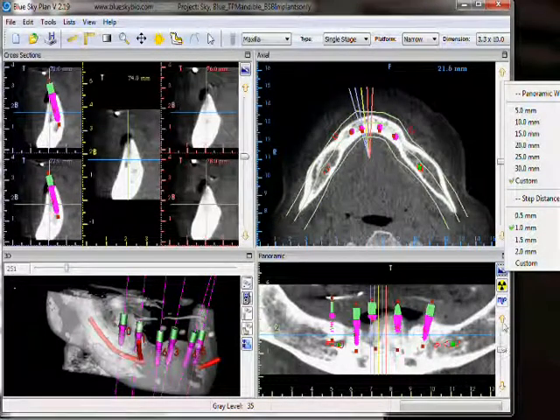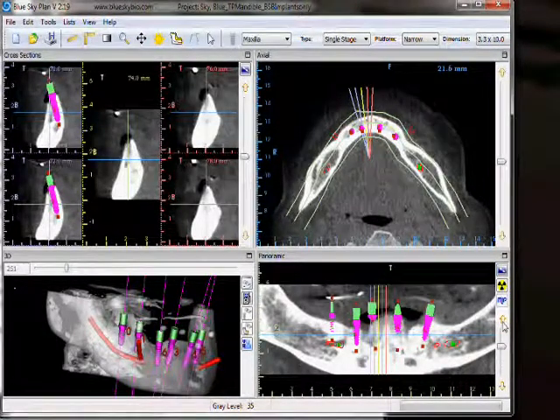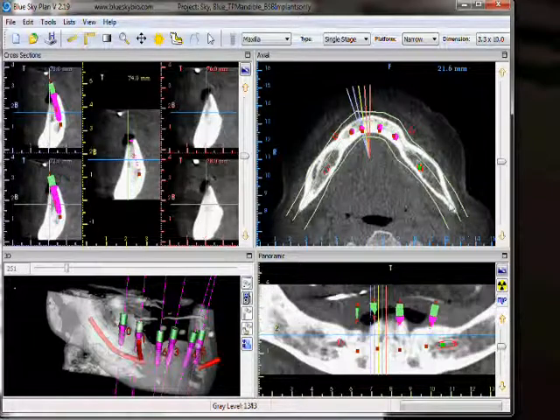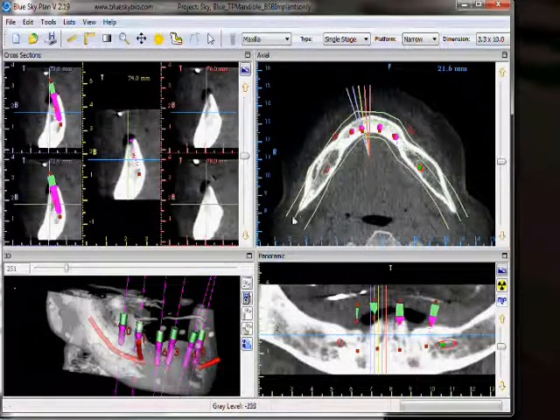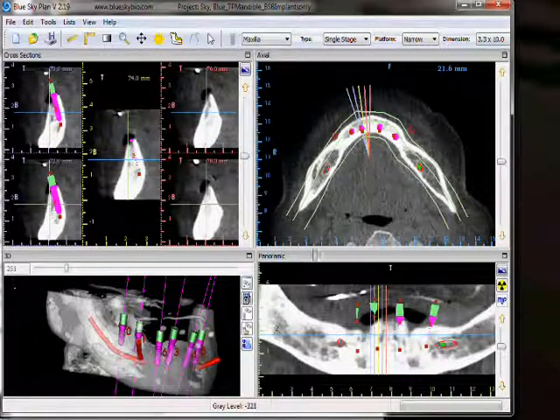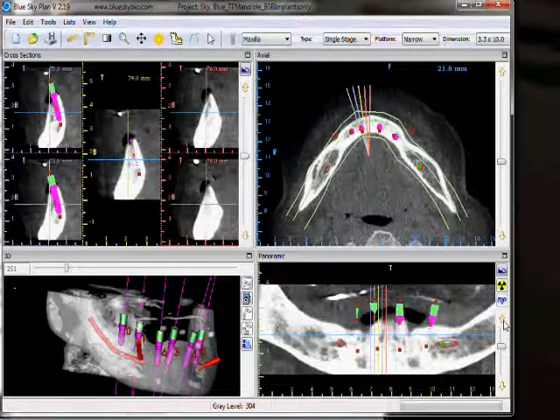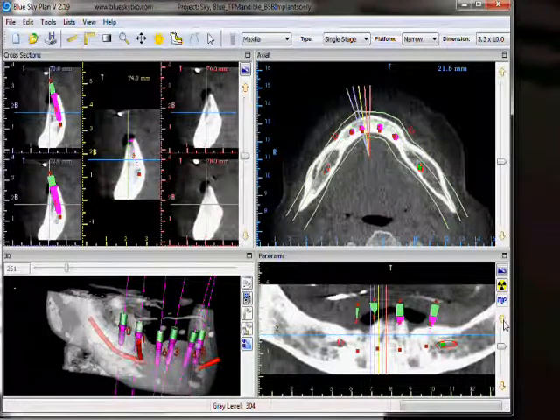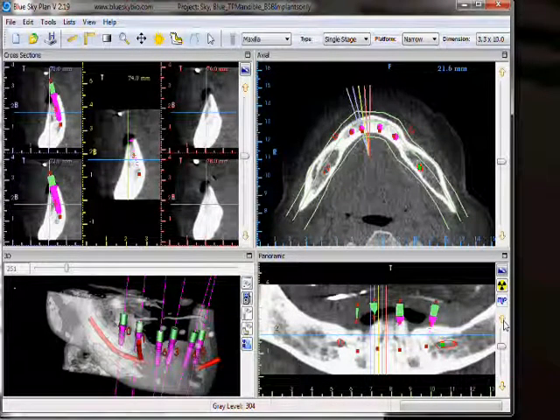Please note that as we click on the up arrow, our middle yellow panoramic curve moves accordingly. It is indicating for us, along the horizontal axial plane, the exact location of our vertical panoramic slice.